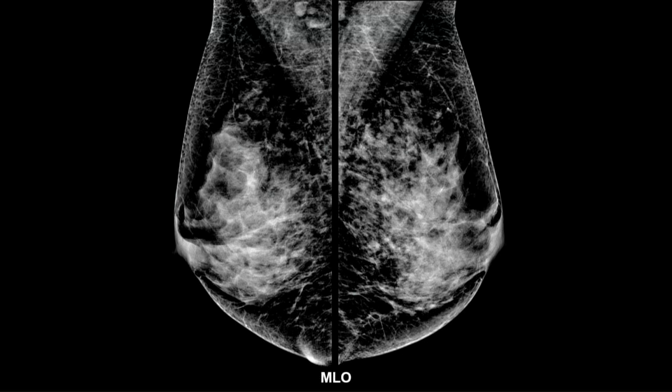Before I go on with this, some of the slides are going to look very high in contrast. That's because this particular equipment manufacturer produces higher contrast images. On the workstation, it looks fine.